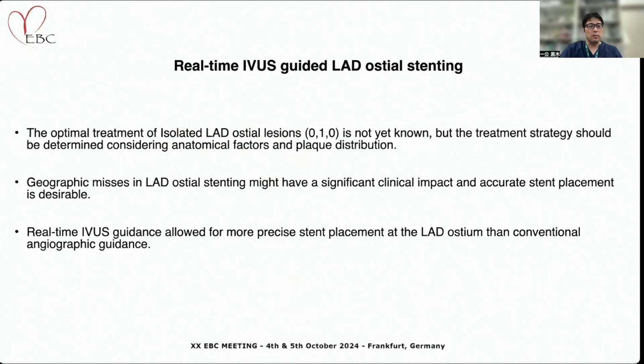And this is the conclusion. The optimal treatment of isolated LAD ostial lesions is not known, but the treatment strategy should be determined considering anatomical factors and plaque distribution. Geographic misses in LAD ostial stenting might have a significant clinical impact, and accurate stent placement is desirable. Real-time IVUS guidance allowed for more precise stent placement at the LAD ostium than conventional angiographic guidance. Thank you for your attention.